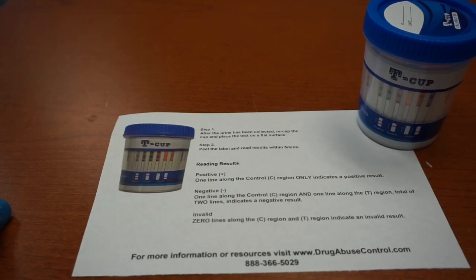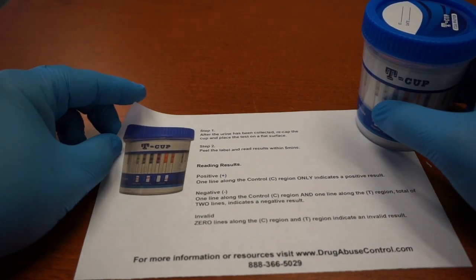This is the instructions on how to use the T-Cup 14-panel drug testing kit. With each of the kits comes the instructions, which shows a two-step process.